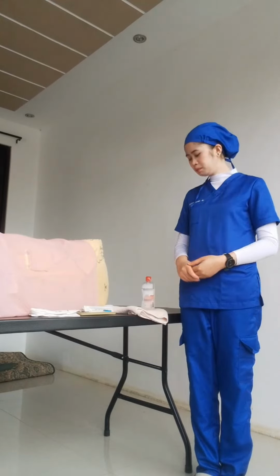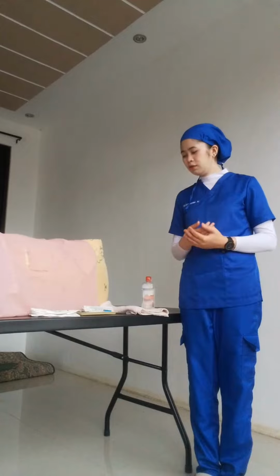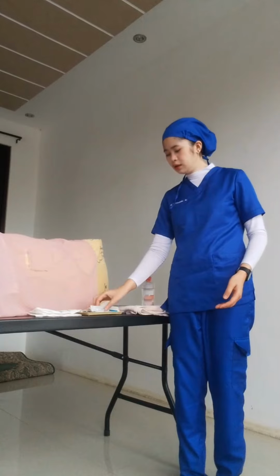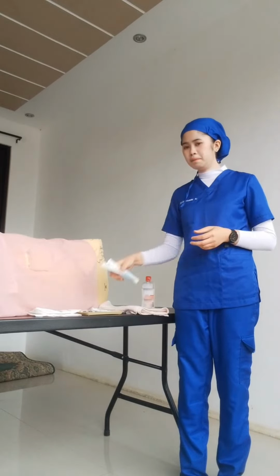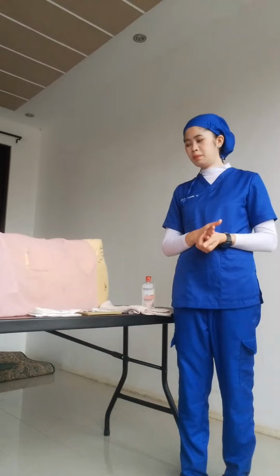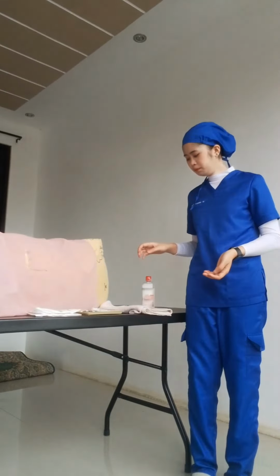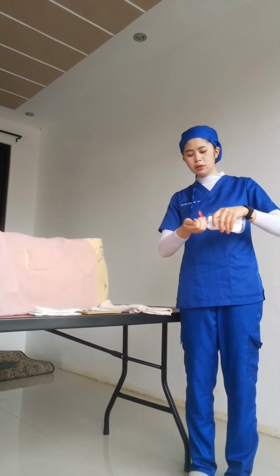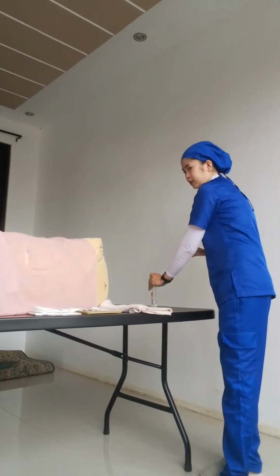purposes. So the equipment to be used are, first, the sterile gloves, the sterile tray, a 5 cc syringe needle, and also a treatment towel and a towel that is needed to do a puncture. Before we start the procedure, I am going to disinfect my hands with alcohol to minimize the spread of microorganisms.